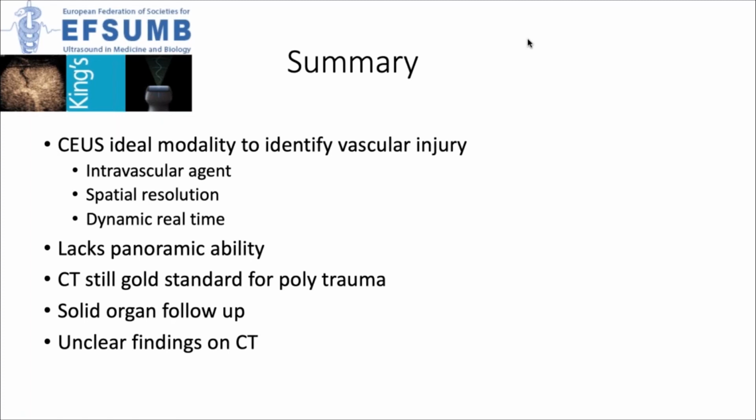However, in a situation such as on a battlefield, it may well be that contrast enhanced ultrasound shows its utility when you have a defined entry and exit point, such as a left upper quadrant stab wound. You want to identify splenic trauma, where CT is simply unavailable. And I think the biggest utility is in the follow-up of solid organ injury, where we can spare patients unnecessary CT of what is already a very oversubscribed modality.